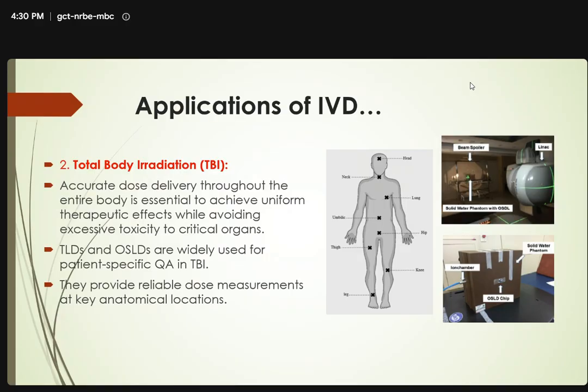So, the picture is showing two different types of setups. The conventional setup where we were exposing the patient with a lateral setup where the gantry was either 90 or 270 with a certain distance.